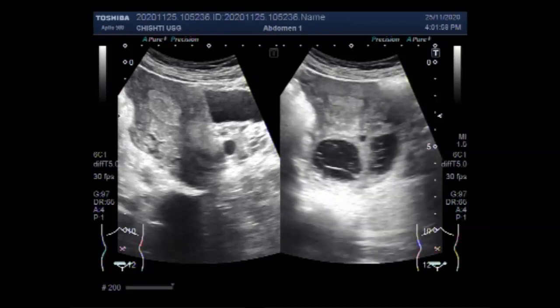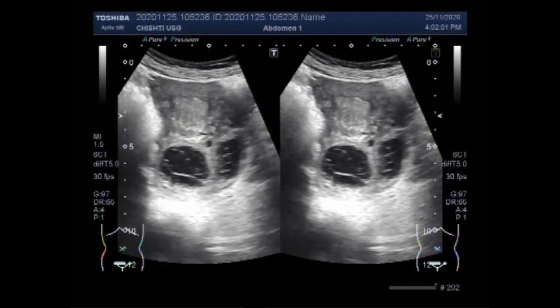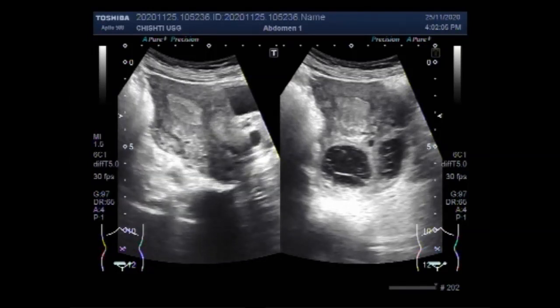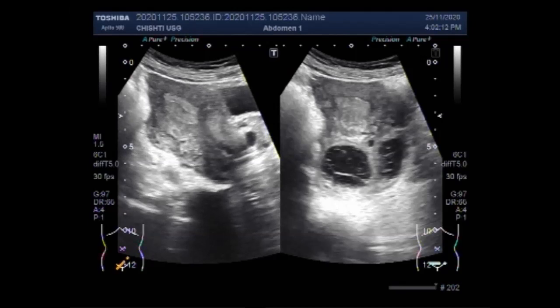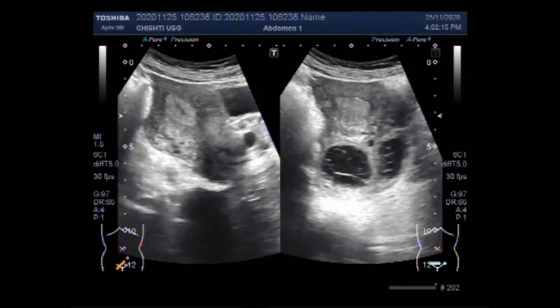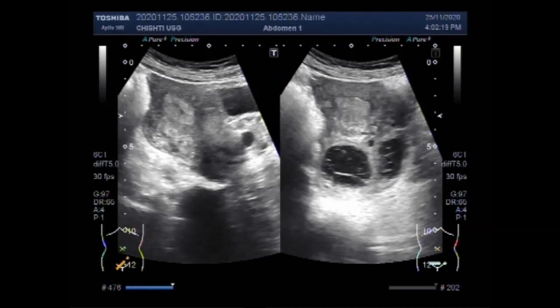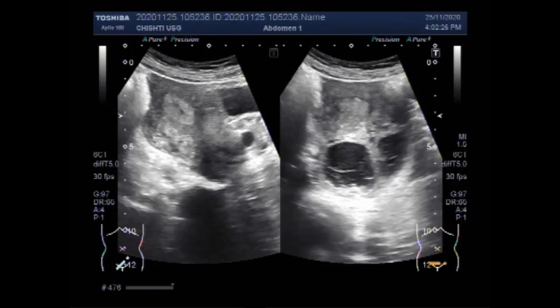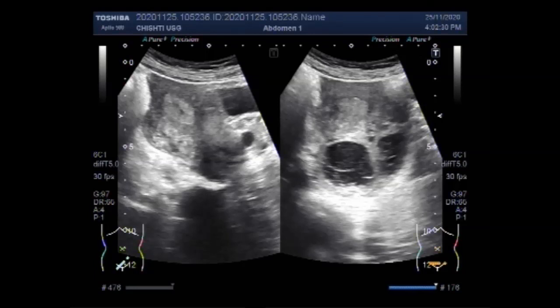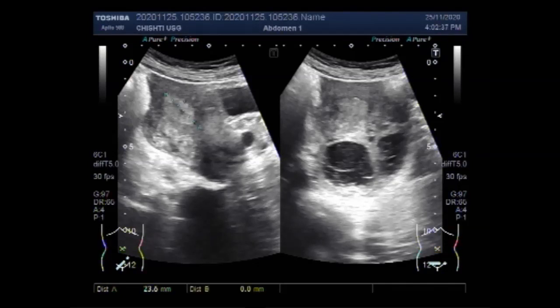Now you can see both of the hemorrhagic ovarian cysts along with the uterine polyp and a small cervical cyst. The cervical cyst measures about 1 centimeter in diameter. The main difference between fibroids and polyps is the tissue they are made of, as fibroids are made of connective fibrous tissue, whereas polyps are made of same tissue that makes up the uterine lining, also known as endometrial tissue.